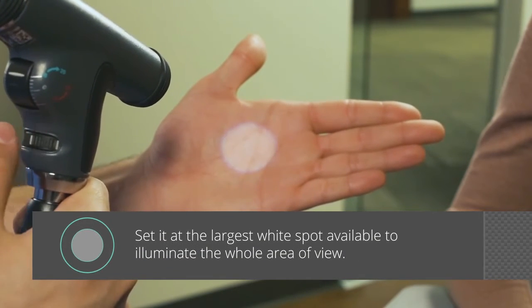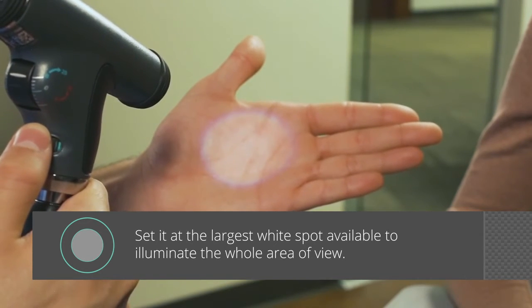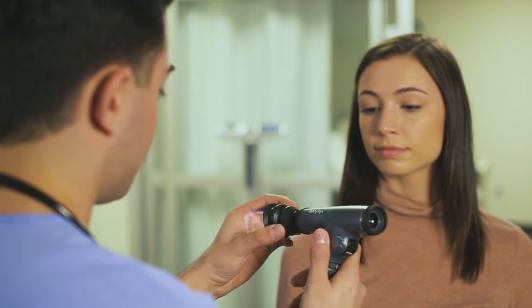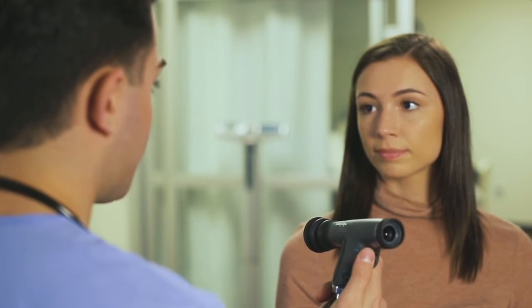To start, set it at the largest white spot available to illuminate the whole area of view. The eye cup helps keep the device stable and helps ensure the correct working distance. During use, make sure to compress against the patient's brow and explain to them that it will not touch their eye.